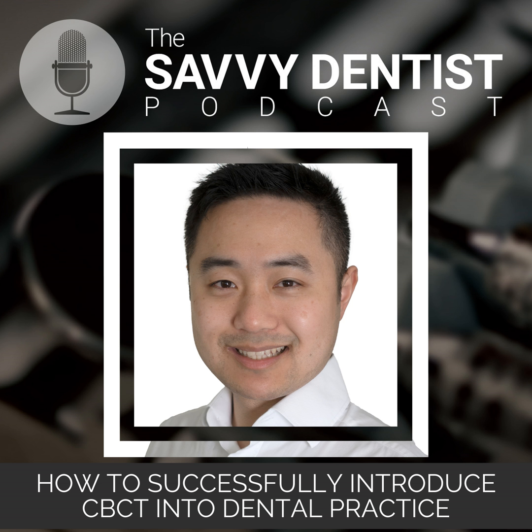Yeah, of course. For practice owners that own a CBCT machine, they have 2 aspects of responsibility. As you mentioned, one is the reporting and interpretation, but I'll just quickly touch upon the other one, which is the actual acquisition. If you own the CBCT machine, in order to be licensed to press a button, you do need to do a course. It's very different from state to state. So different radiation authority bodies have different rules. But in general, you have to sit a CBCT licensing exam. Once you pass that, you can now press the button. So we sort out that area.